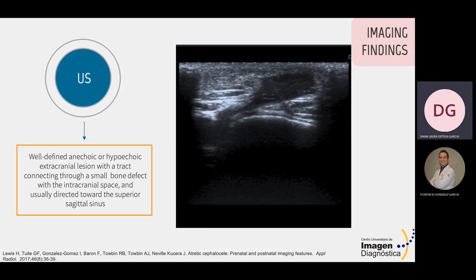The imaging findings across different modalities are as follows. By ultrasound, we can observe well-defined anechoic or hypoechoic extracranial lesions with a tract connecting through a small bone defect with the intracranial space, usually directed toward the superior sagittal sinus.